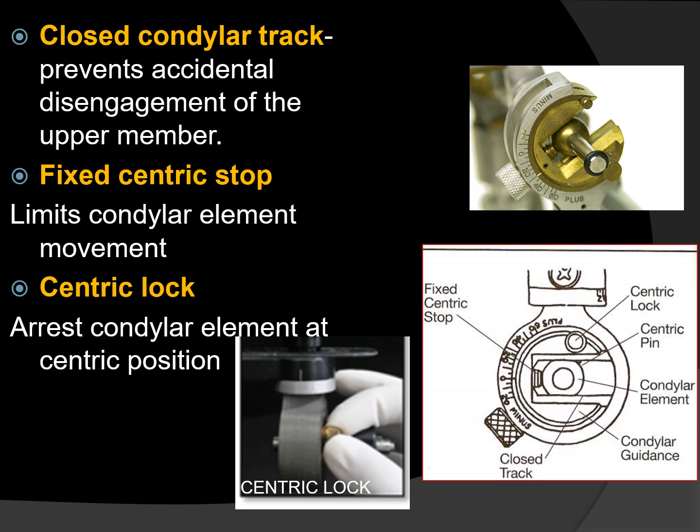Now at the posterior end there is another component which is called the centric stop. The centric stop limits the movement of the condylar element. So when the condylar element rests against the centric stop, it is at the centric position. So during articulation, the condylar element should rest against this centric stop.